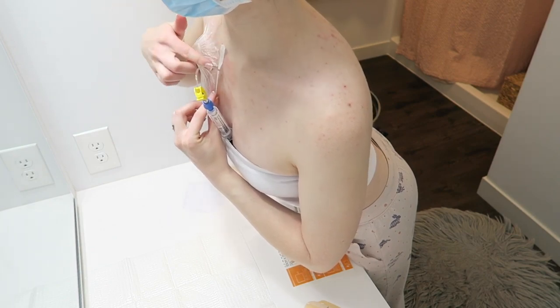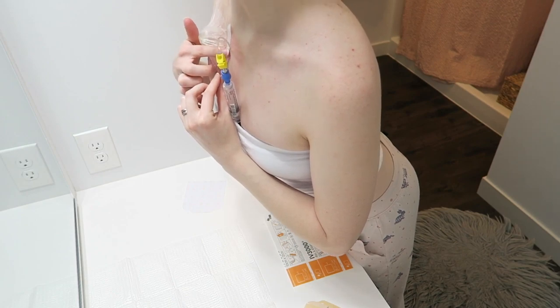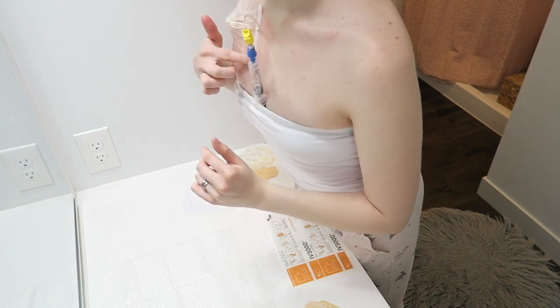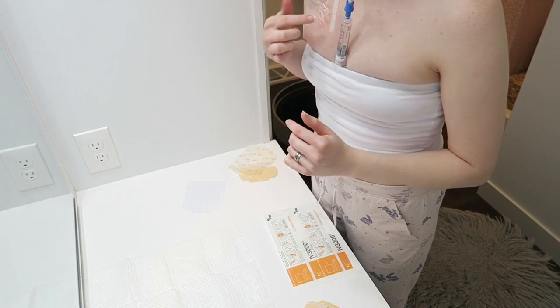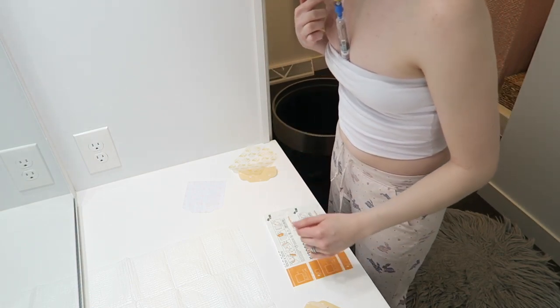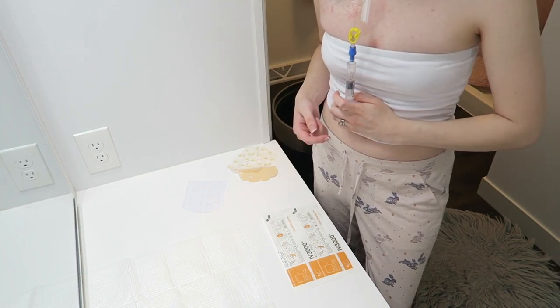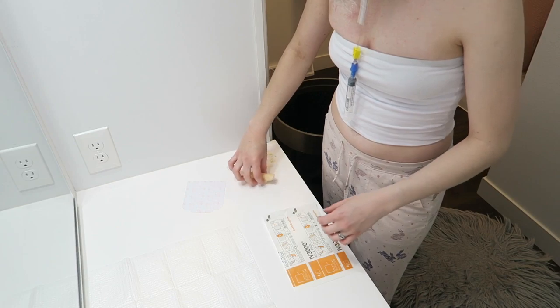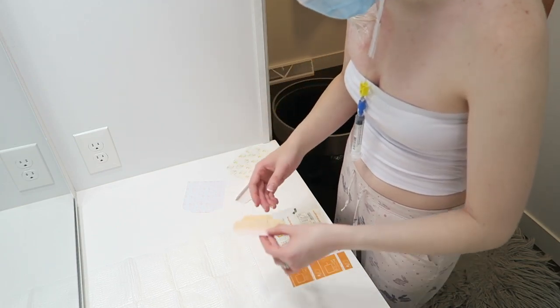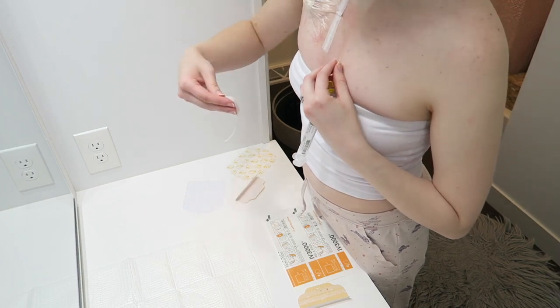So I'm gonna put one on. I'm not putting it on top of the dressing, I'm putting it right next to it, and I'm putting it over that tubing. So that way, if I do get pressure on the tubing, hopefully it should tug this before it tugs the actual dressing. So I'm actually just gonna push the rest of the saline through the port. And now I'm going to take the other strip and I'm going to put one this direction.